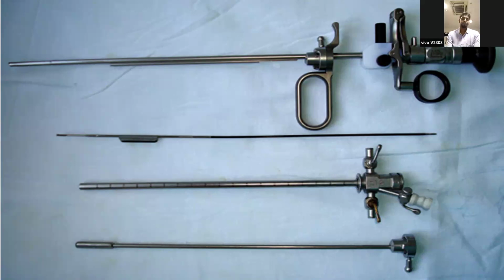All these opposites apply to the passive. It stays inside, depth is decided, it is slow in action, so it is a controlled resection. But the speed is less. So that covers active and passive.